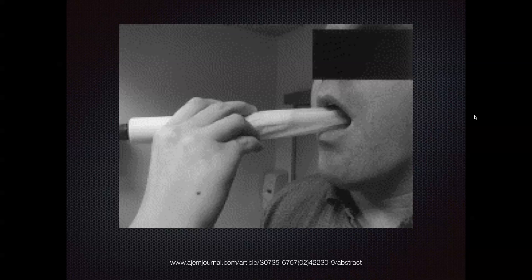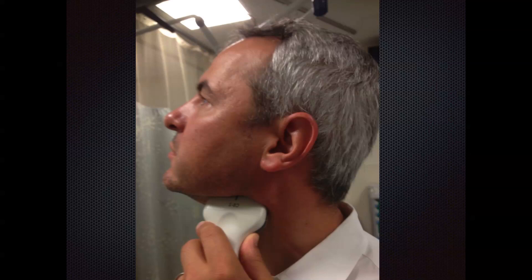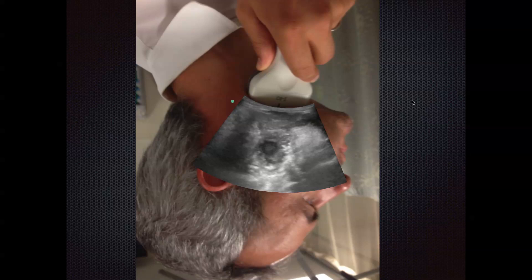The other problem is we didn't have this endocavitary probe. So what we did is we actually used a curvilinear probe — and I've done this before also with a linear probe. You can see the probe marker pointing posteriorly and the front toward the front of the mouth. So if you think about what this looks like on your screen: here's the tonsillar area, the carotid is right here, and here is air and tongue with the inside of the mouth.